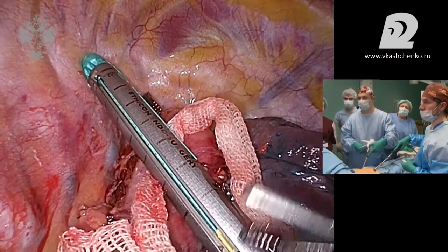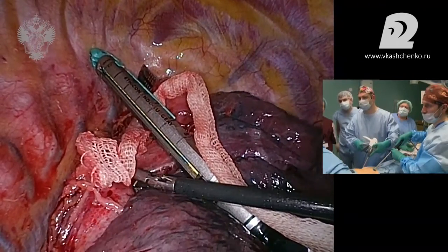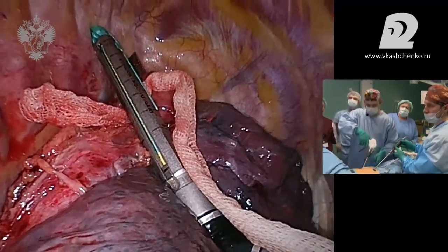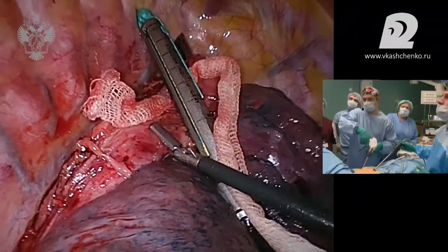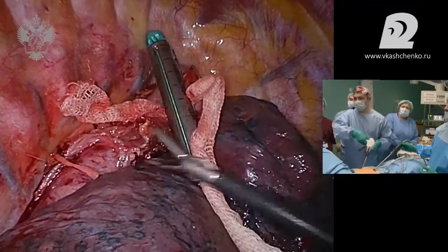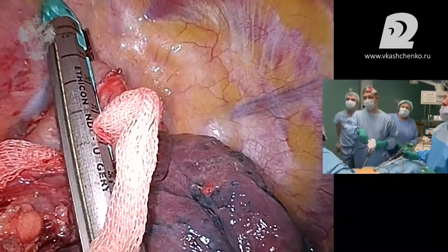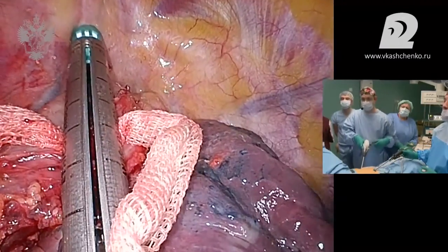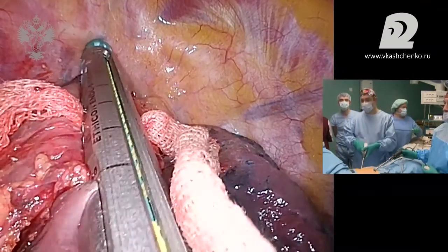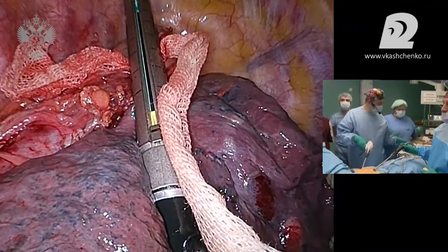So we locate it in such a way that it will stay on the proximal end. I'll pull the esophagus downwards a little bit. That's not bad, like this. We have to wait for compression. It's not a complete zone, the final zone of the resection, but the situation will allow me to continue.